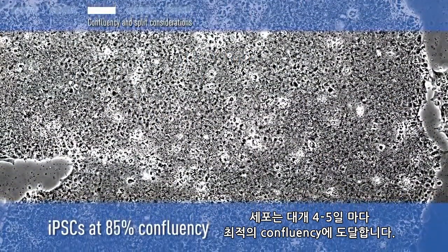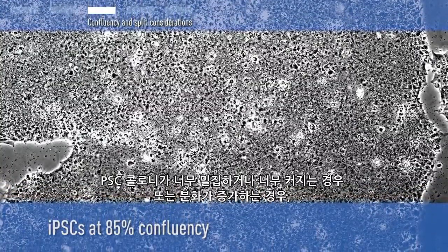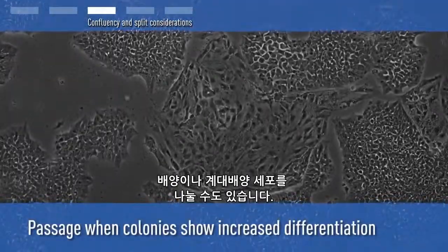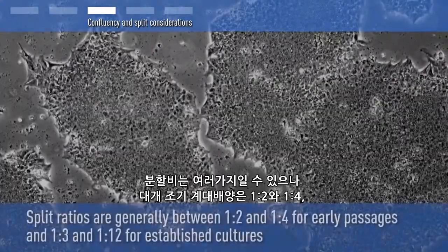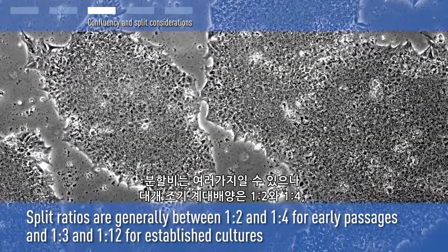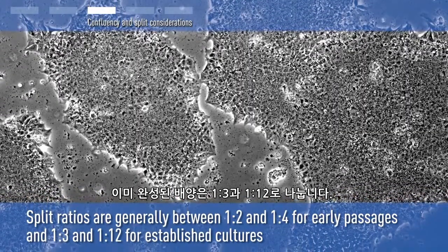Cells will reach optimal confluency typically every 4 to 5 days. You should also split cultures or passage cells when PSC colonies become too dense or too large or show increased differentiation. The split ratio can vary, although it's generally between 1:2 and 1:4 for early passages and between 1:3 and 1:12 for established cultures.